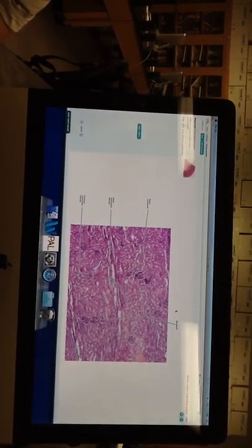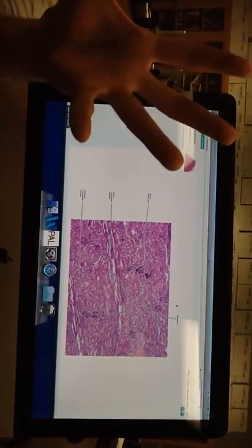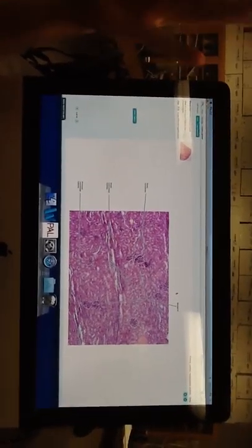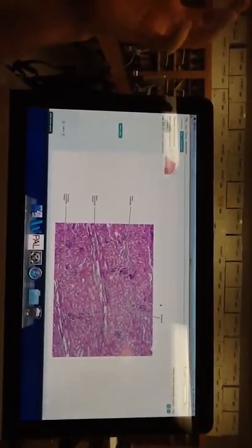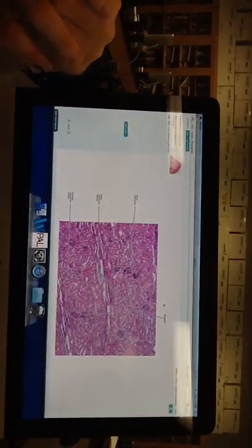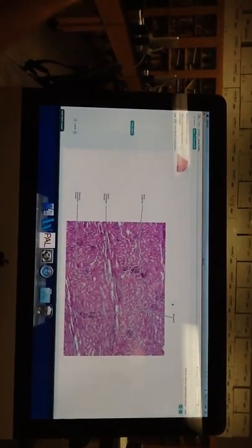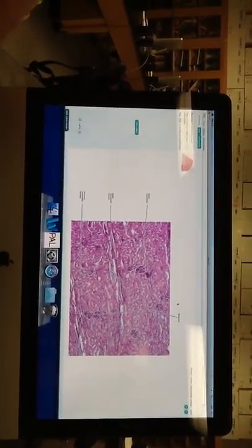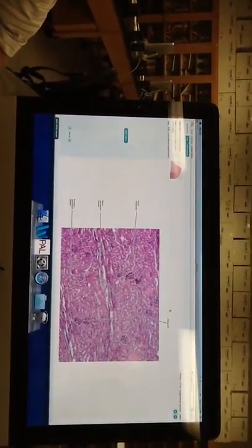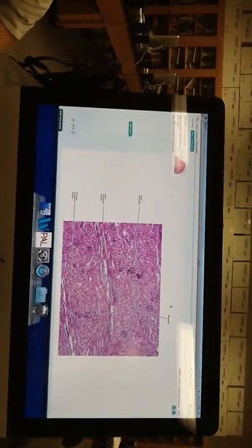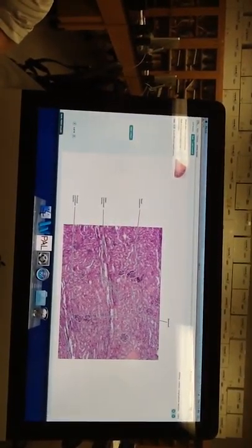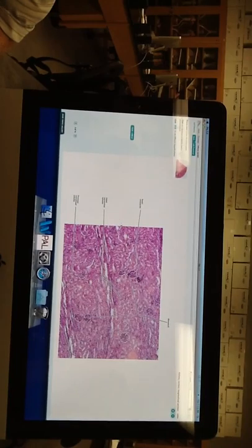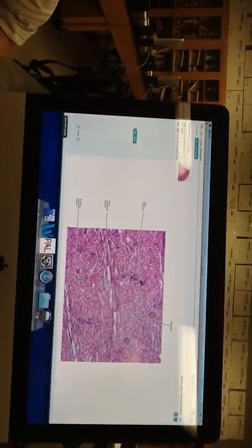The real thing that you can tell apart in the kidney are what we call the Bowman's capsules or the glomeruli. See those regions? That's where the fluid comes out of the blood because what the kidney does is it regulates fluid levels. And most of the fluid comes out of the blood in these very specialized, very porous, if you remember from A&P1 fenestrated capillaries, they have lots of... Well, you'll see it.